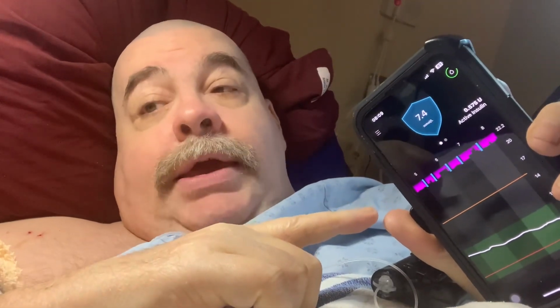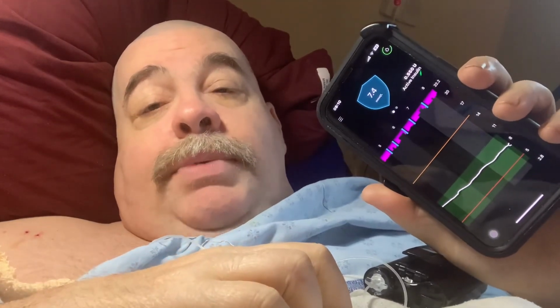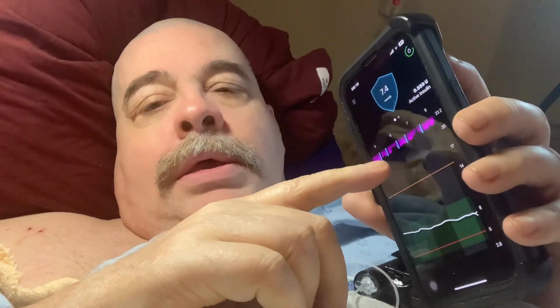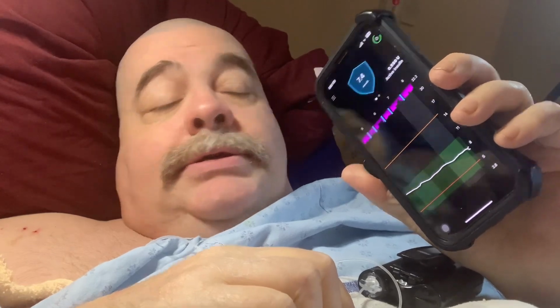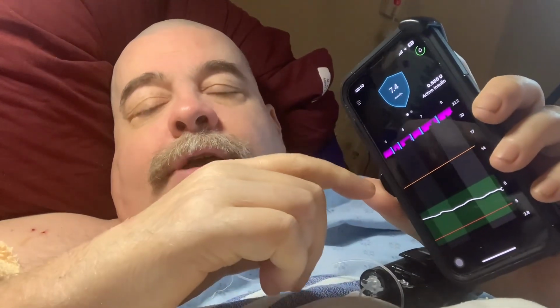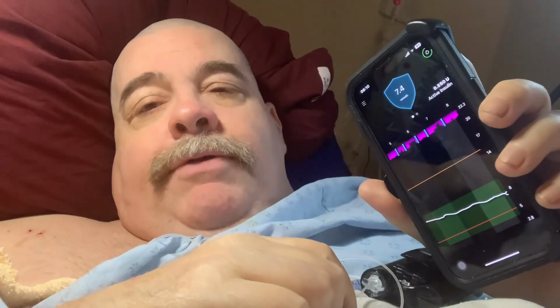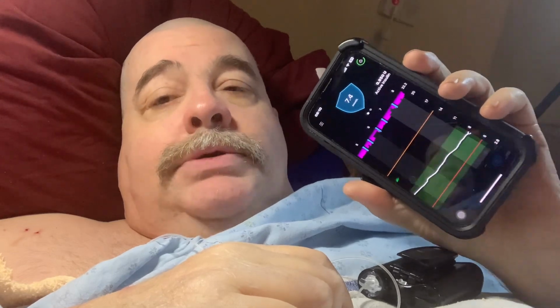So I know it really kind of annoys doctors when they say, so what is your basal rate? Oh, I really can't tell you because it modifies. This is what your pancreas does. So this is monitoring yourself the same as any other pancreas. The blue lines. My pump automatically corrects. If I start to go up, it will give me blue lines. If I start dropping, it will stop giving me insulin. That's pretty much how the Medtronic pumps work.